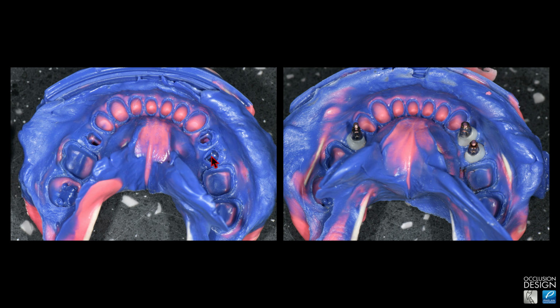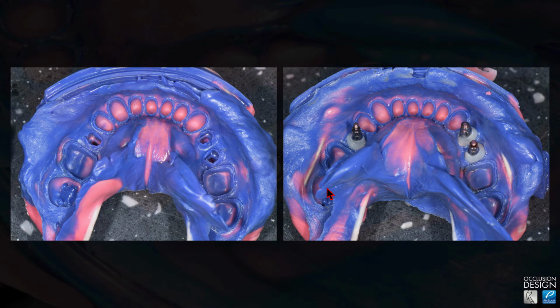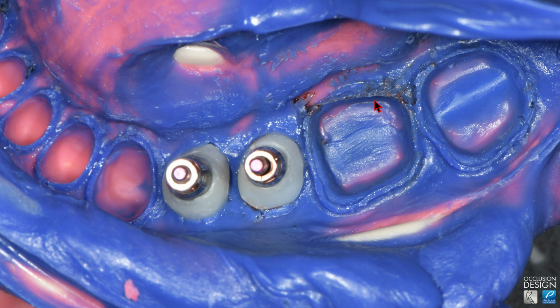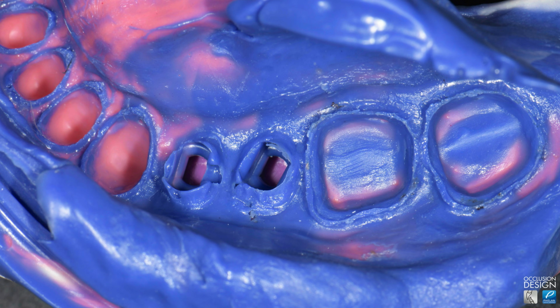So I put in some stock closed tray impression transfers and did the impression, and got the tooth that was not perfect in the impression. Everything else was really good. We used this to make the die on that one tooth. The rest of the case was built on this. There was a little tear here. It wasn't quite perfect. You can see the impression here. There's the one where I think there was a little tear, and there's the better one. Just as a precaution, because I'm putting all these provisionals in, I'd rather have an extra impression if I feel I need it.